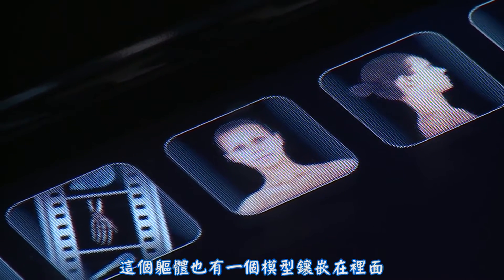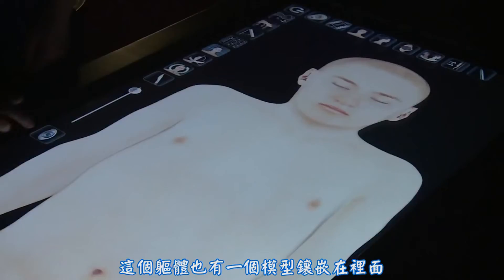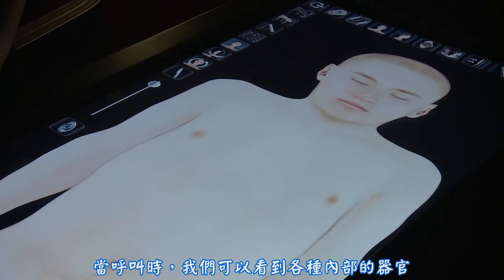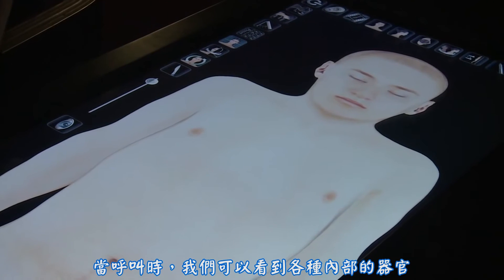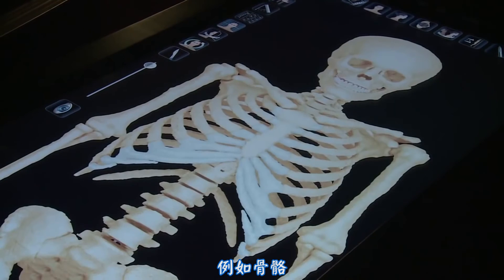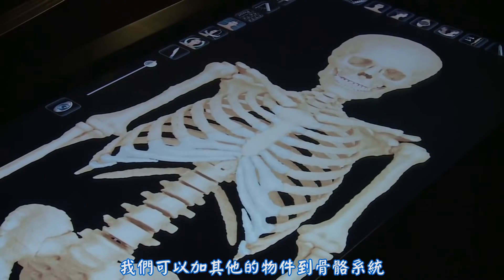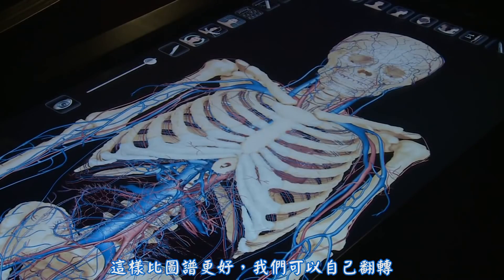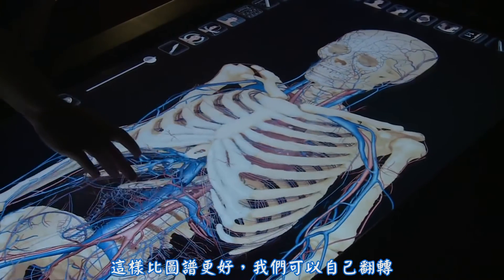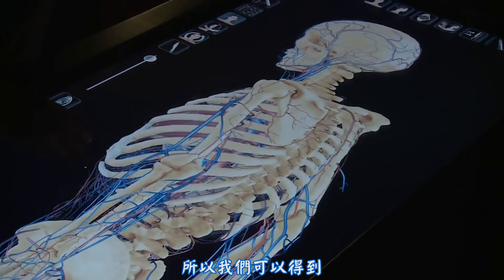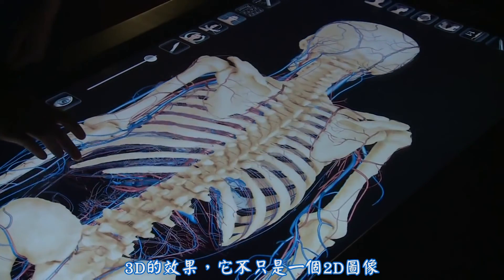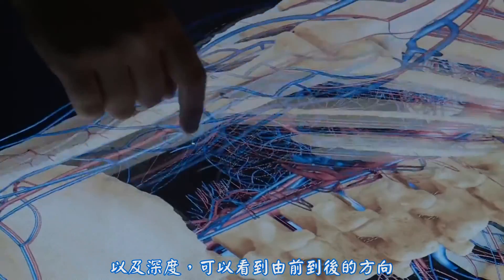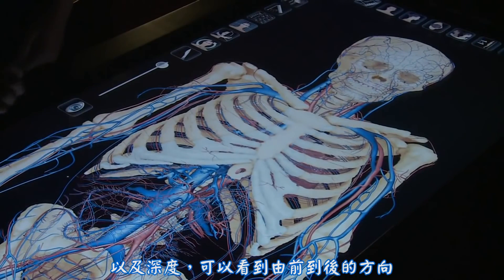This body also has a model embedded into it where structures have been rendered out. And we can see the various internal organs. So there's a skeleton, and we can add things to the skeleton. For example, we could add the cardiovascular system to it. Now we can rotate it. This is where it's better than an atlas — we can actually spin this round so we can get that 3D effect. So it's not just a 2D image we're seeing here. We can see structures in a depth way so we can see where they lie in an anterior-posterior direction into the body.